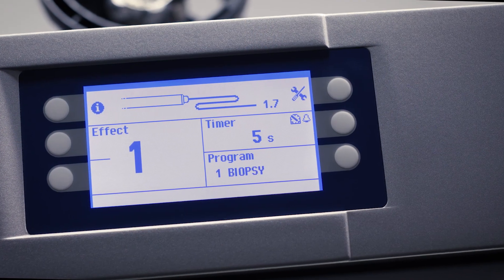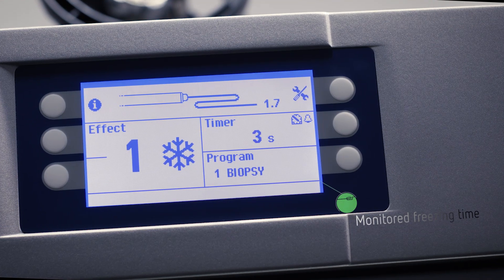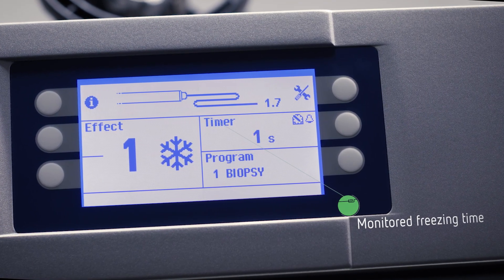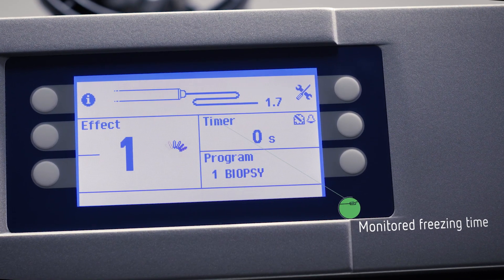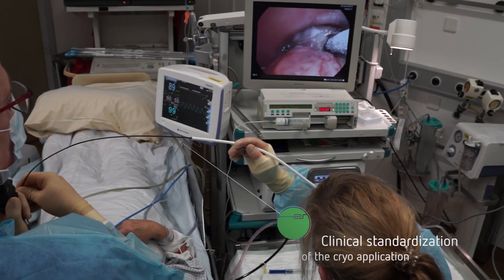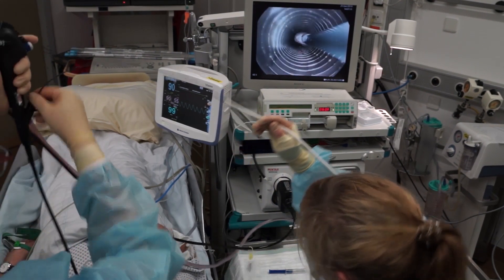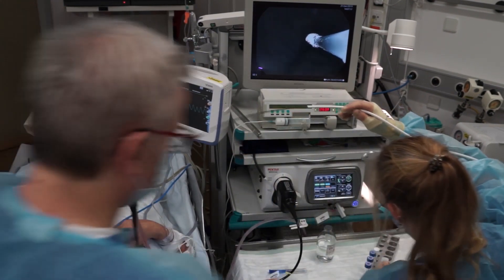In addition, freezing time is another important factor for the desired tissue effect. It can be controlled visually and acoustically via the timer. The Herba Cryo 2 cryosurgical system enables reproducible freezing results and thus supports standardization of the clinical application.